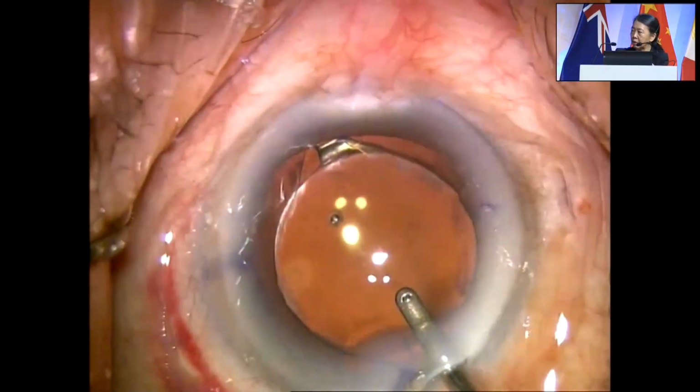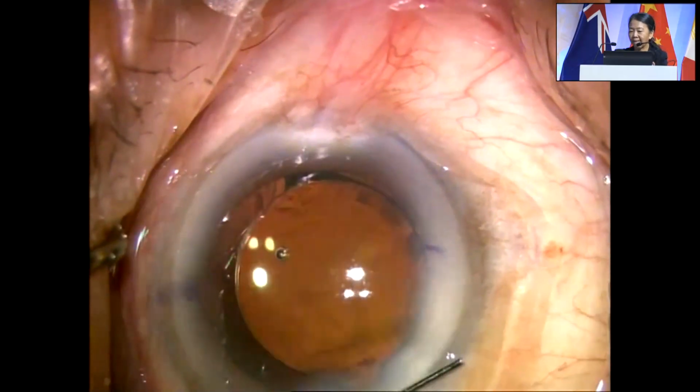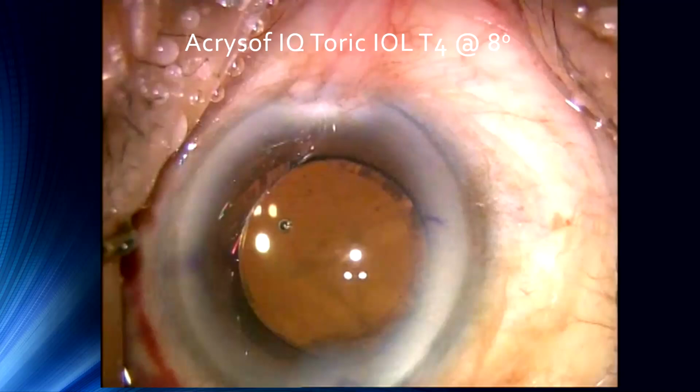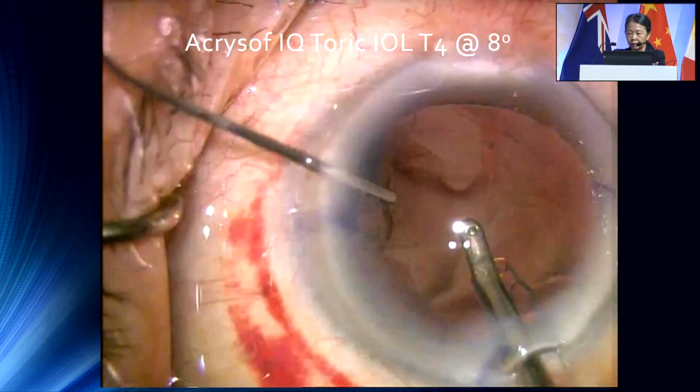You want to comment on this, Dr. Titiel or Ramamurthy? Oh, I think these lenses are very stable, but now with the roughening up of the haptics with some of the other lenses that I showed, the stability is even better. Yes, agree. With the Technics platform, it's so difficult to even shift it when I want to move it 1 degree. So anyway, this is how I got away with this eye. It ripped right across there with a femtocapsulotomy, but fortunately this patient did well.